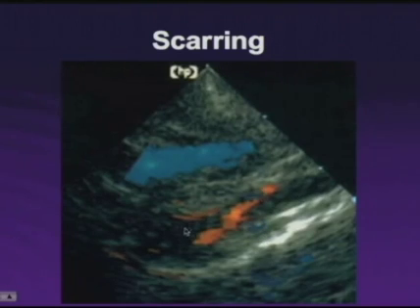It's filled with middle-level echogenic material, and the lumen is reconstituted in a regular shape, smaller in this region, larger in this region. And this irregular lumen, again, indicates the recanalization, partial recanalization of the material and the scarring in the vein.